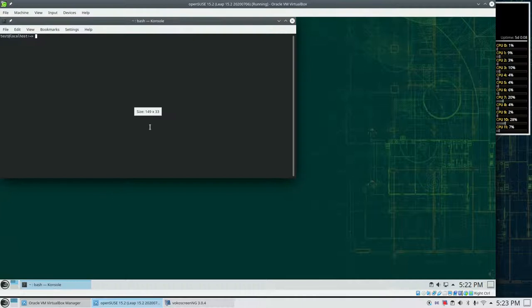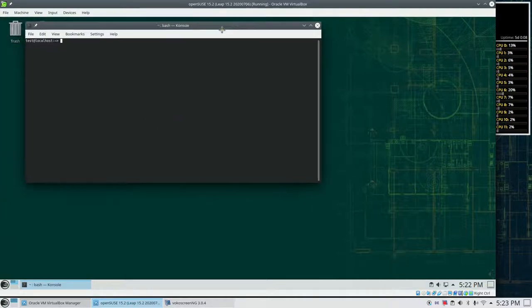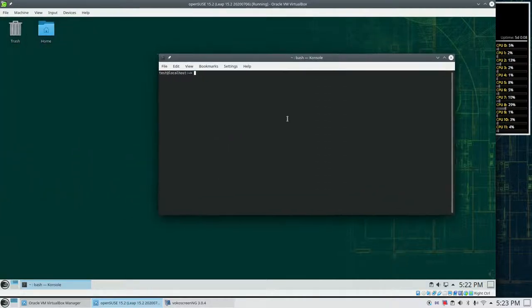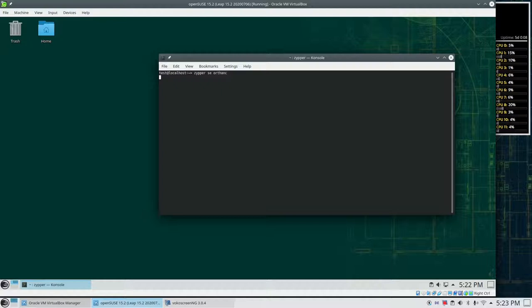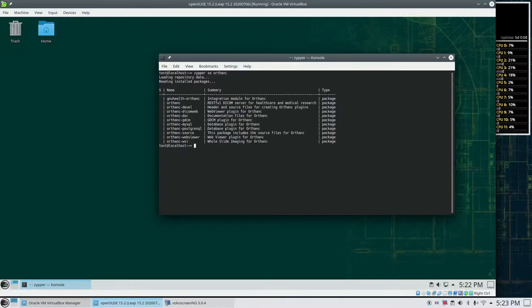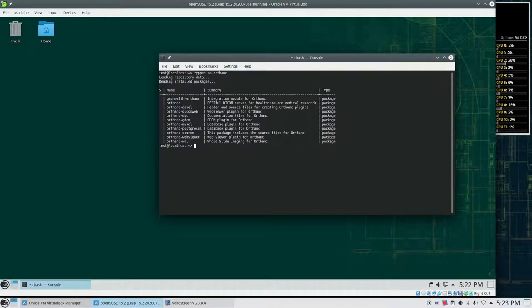First of all, we use a command line tool. This is called Zipper and we search for Orthanc. So we've got a couple of matching results for Orthanc.